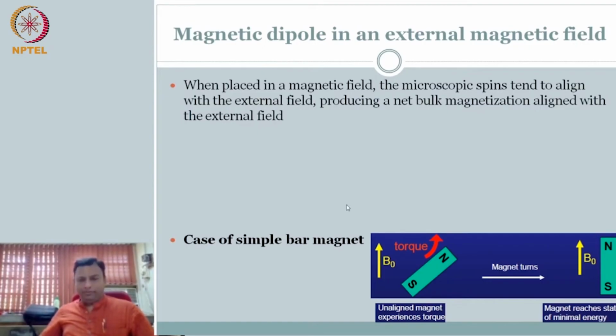What is going to happen? Well, your first guess is, just because there is an analogy drawn, you would expect that the spinning nuclei will also align themselves to the direction of the external magnetic field. And that is partially correct. I mean, it has to behave very similarly.